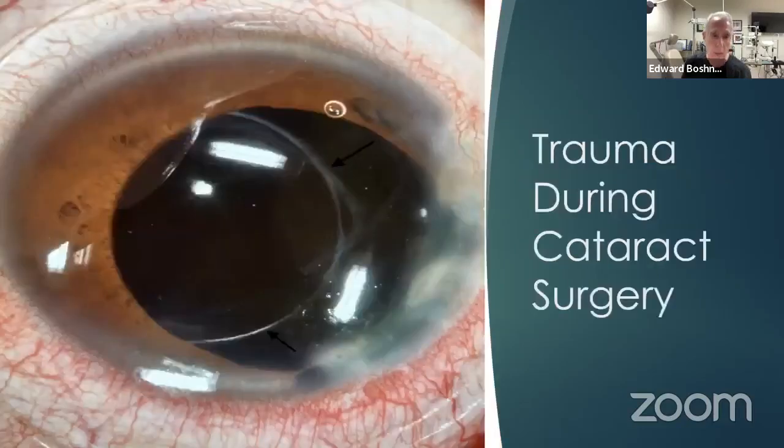Here is another eye. This patient was taking medication for restless leg syndrome. And during cataract surgery, the patient's body and leg shook violently. It took several technicians to hold him down. All of this while the cataract surgeon was inside the eye. So you can see part of the iris is ripped away, and you can see the IOL there.